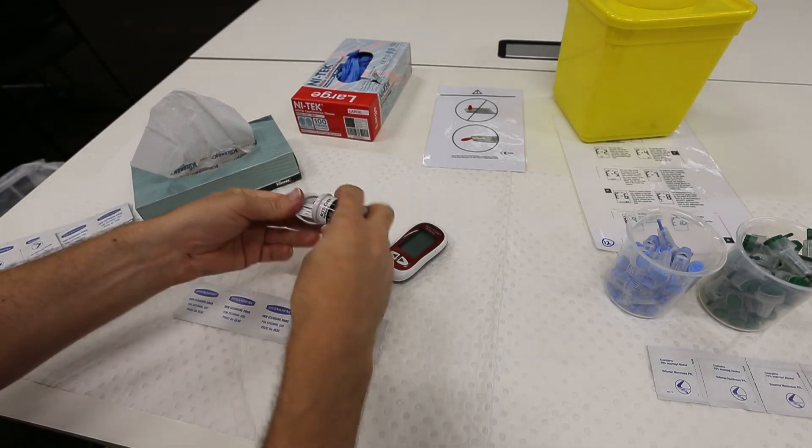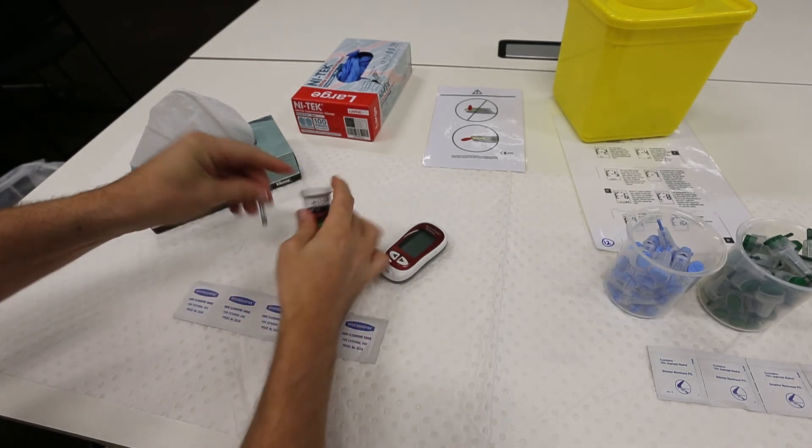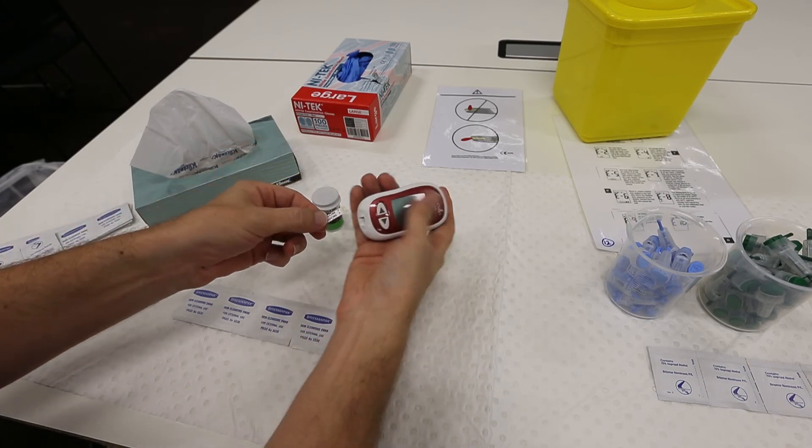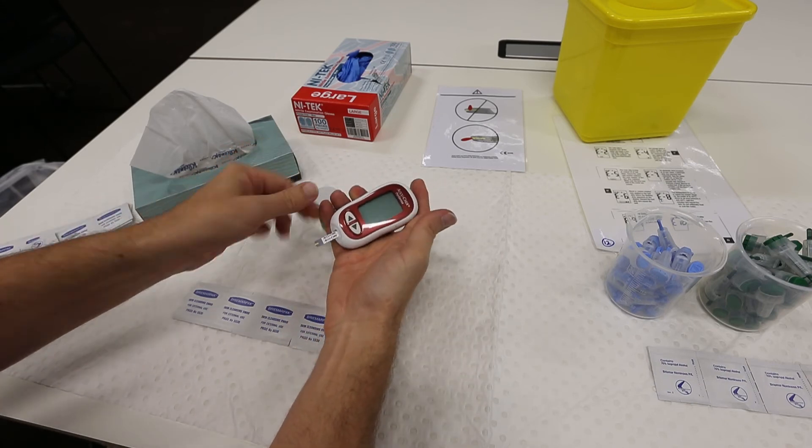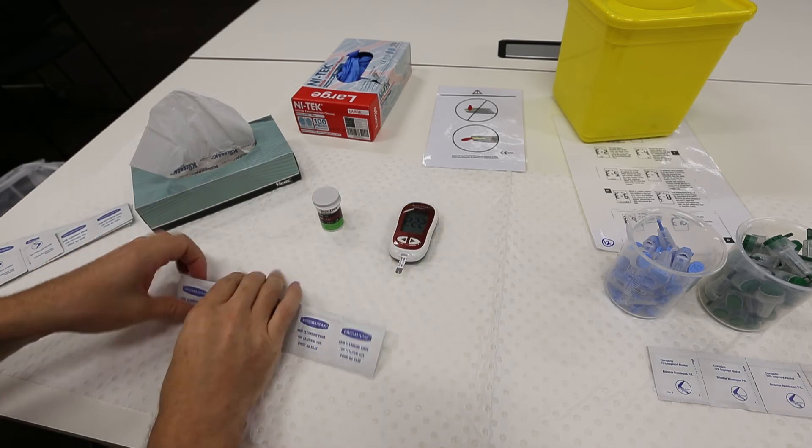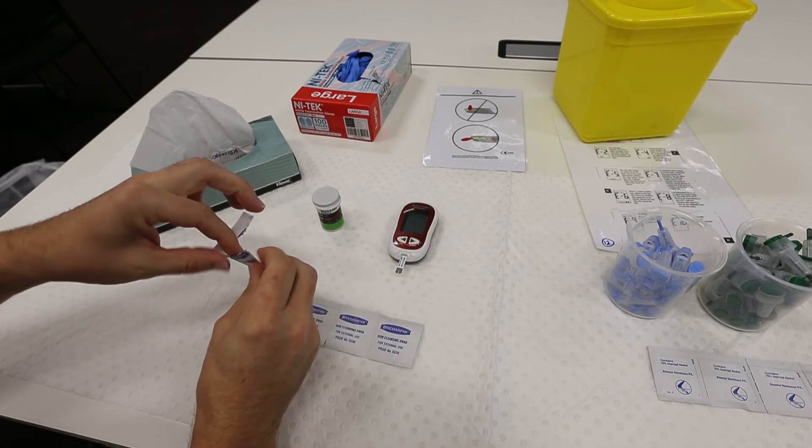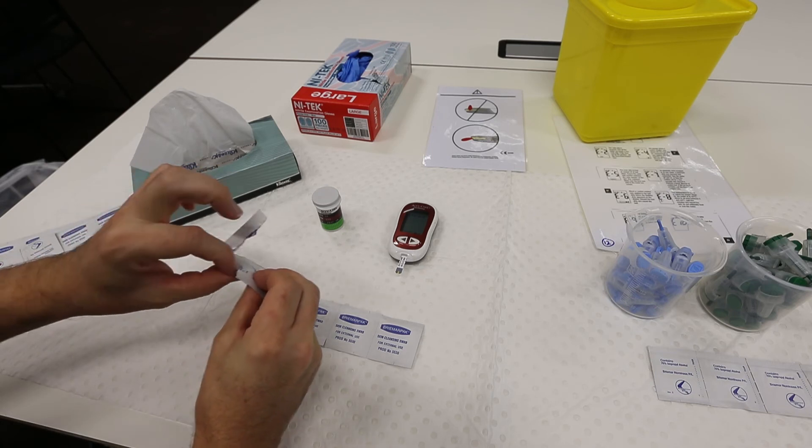Now we will demonstrate the whole procedure from start to finish. First of all, take one of the glucose test strips and insert the copper electrode end of the test strip into the glucose test unit. Next, take an alcohol swab and sterilize your chosen finger.